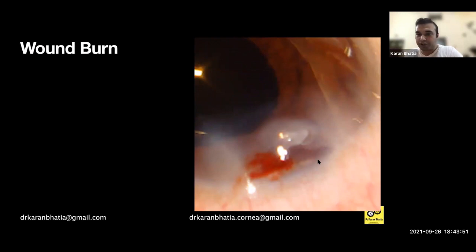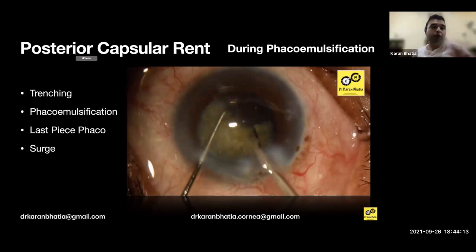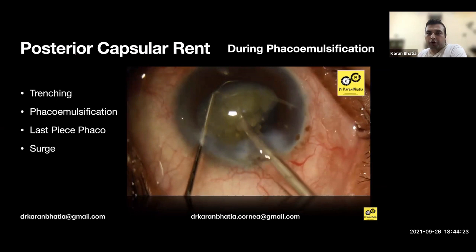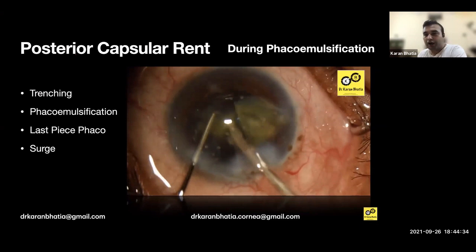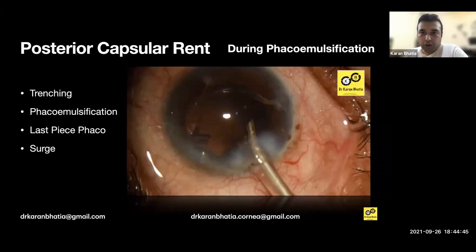Don't make a wound that is too snugly fit — it can cause wound damage. Any FACO injury touching the wound with power on causes wound burn and you'll need a suture. Sometimes posterior capsular rent can occur during FACO — during trenching, during emulsification, during last-piece FACO, or due to surge. In the video you can see routine surgery going well — almost done, just IA and IOL to implant — and suddenly a rent appeared. Let's look in slow motion: the PC was not pushed back and it came and caught the probe.